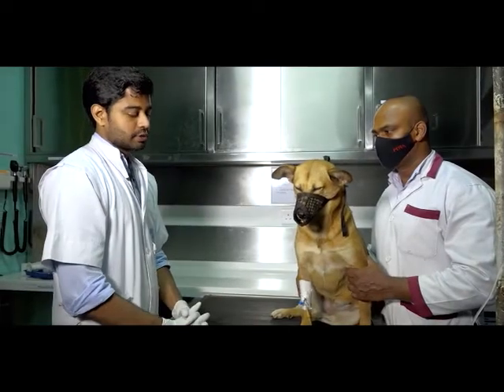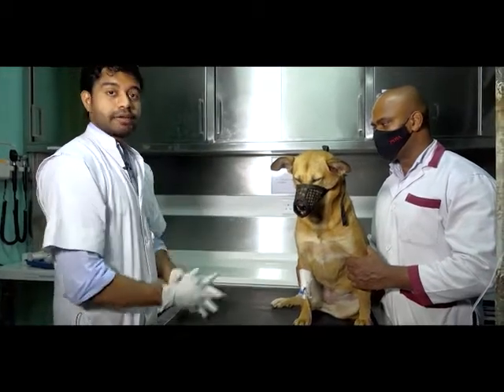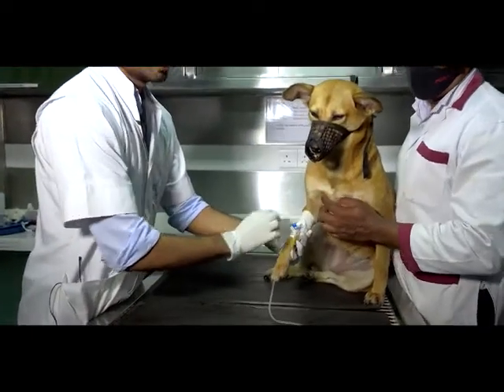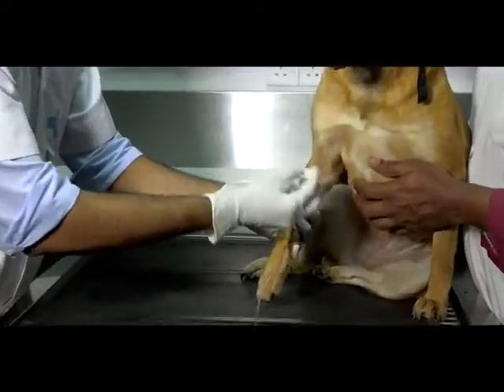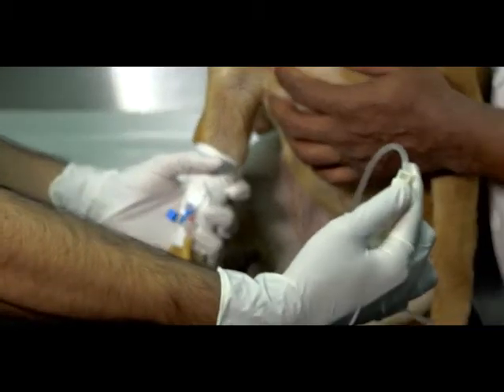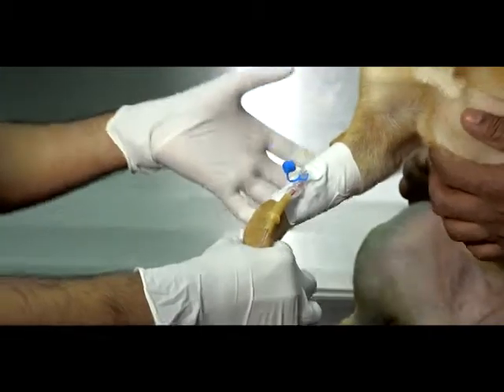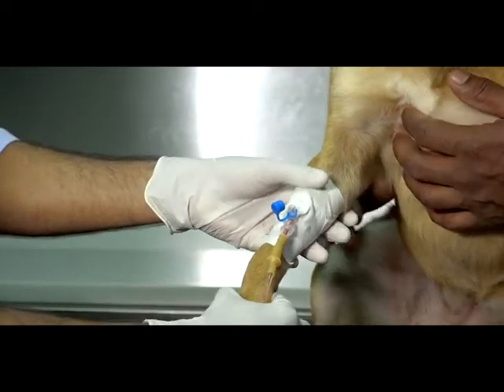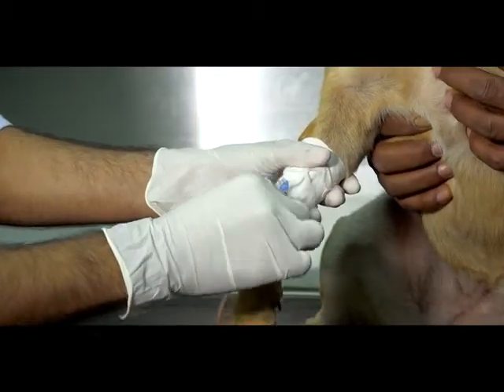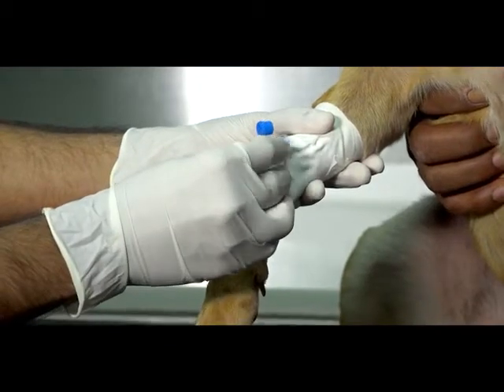Now we're going to demonstrate to you how we are going to remove the infusion set from the cannula while keeping the cannula intact. It's a very simple process. We have the cannula cap attached to the cannula here. You just remove it first. Then you also have to turn off the infusion set. You just turn it like this, so there's no fluid flowing in. And then you can also apply some pressure in the proximal side of the cannula like this, so there's no considerable bleeding while we are removing this. Gently turn it like this, and then close it.